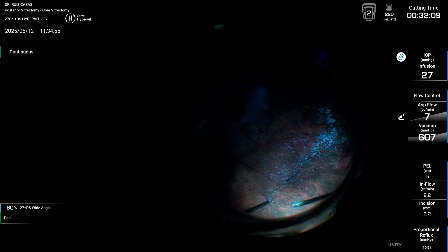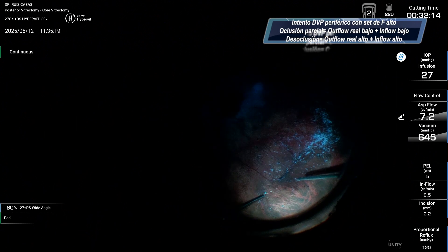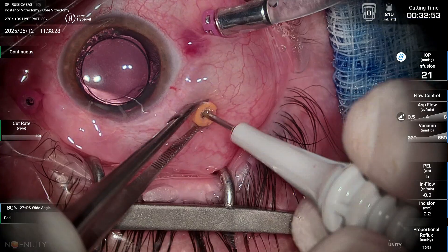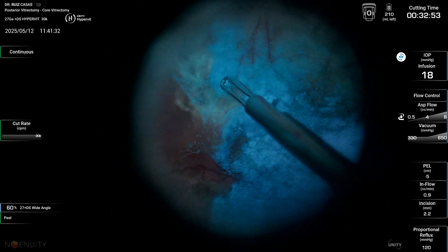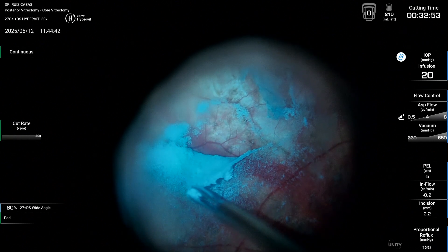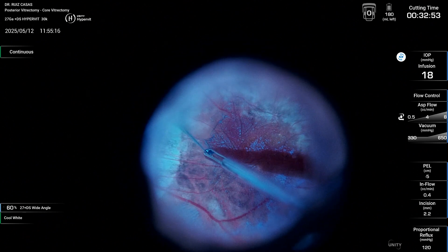You can see here in this area there is a vitreous attachment to the periphery, anterior to the lattice. I tried to detach it and to remove any traction from the lattice to the peripheral retina. But in this case the axial length was so long that I had to change to a 23G microcannula to reach the posterior pole and remove first the vitreoschisis and then the ILM, as you can see now.